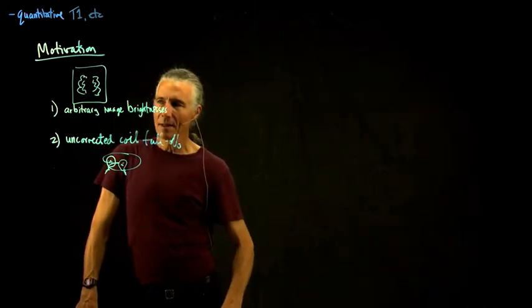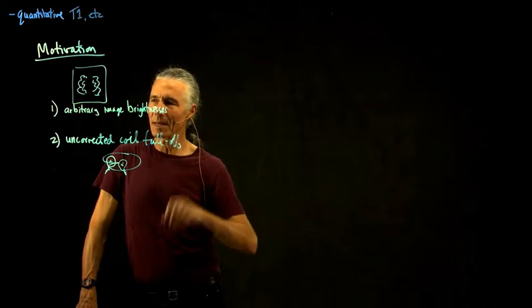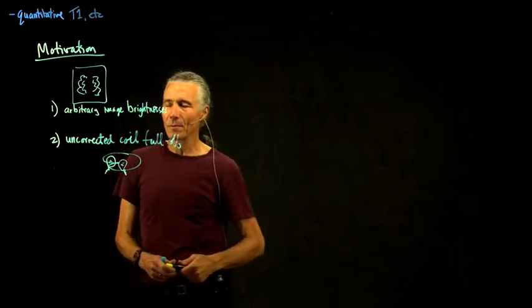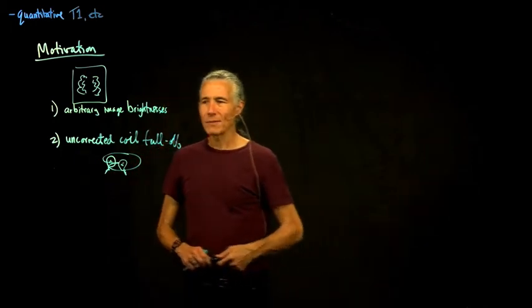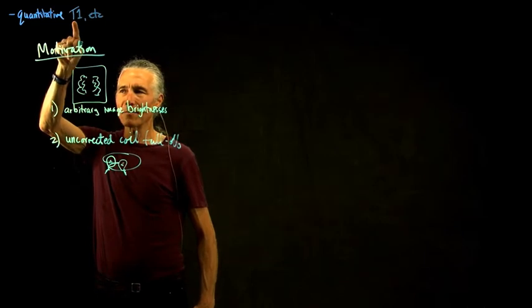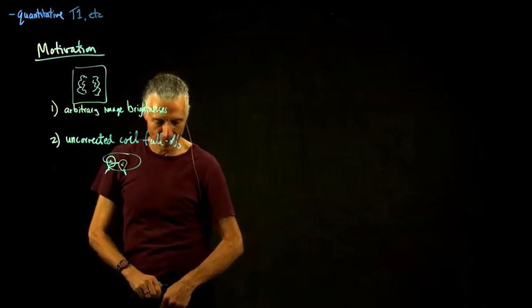You can make some assumptions about what brightness the brain should be and then normalize. There are all different complicated normalization schemes that people have developed. But obviously, if you were able to calculate a quantitative number, that would be a better thing than just trying to fix it afterwards without information.